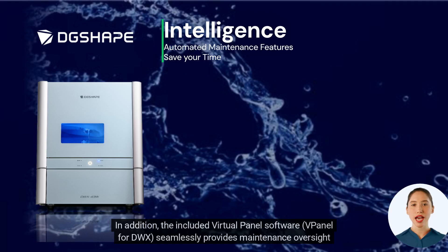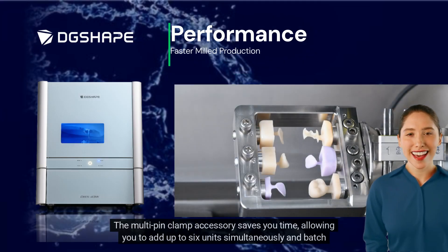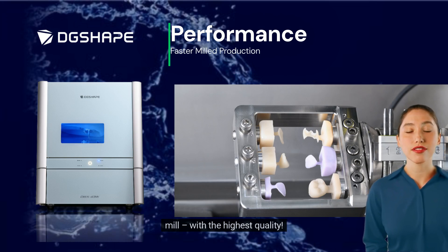In addition, the included virtual panel software, vPanel4DWX, seamlessly provides maintenance oversight and output performance control. The multi-pin clamp accessory saves you time, allowing you to add up to 6 units simultaneously and batch mill with the highest quality.